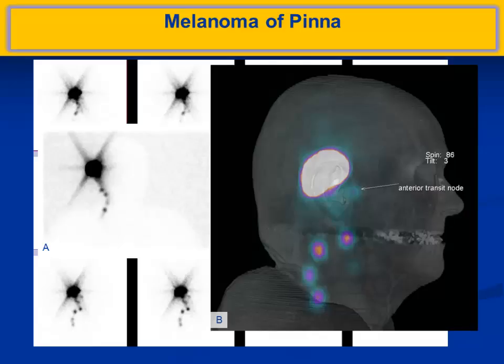This is an example. This is what I was saying about volume rendering. These are the images. If you have this package with you, in fact this is not that good. You can get a patient's image, and you can just see the patient's face in that. You can get such accurate images that it's quite challenging, because now you have to mask the patient details and other things, but the volume rendering is so good, it is exactly like taking a photo of this patient.